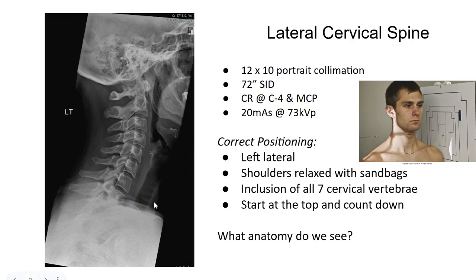And one of the ways we accomplish that is by asking the patient to hold on to sandbags. You can also accomplish that by asking them to exhale when you make your exposure and really emphasizing the importance of relaxing those shoulders. Now, I mentioned sandbags. There is one exception to that. If your patient has any weight restrictions, you would not want to give them sandbags. So always ask your patients, especially if they're post-op, do you have any weight restrictions? And certainly if they don't, then sandbags work really well.